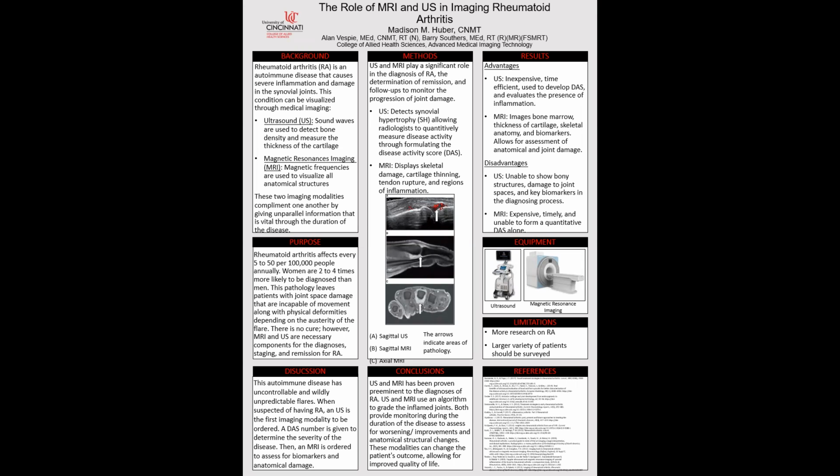in imaging rheumatoid arthritis. Rheumatoid arthritis is an autoimmune disease that causes severe inflammation and damage to the synovial joints. The best two imaging modalities to visualize this pathology are ultrasound, also known as US, and magnetic resonance imaging, also known as MRI.